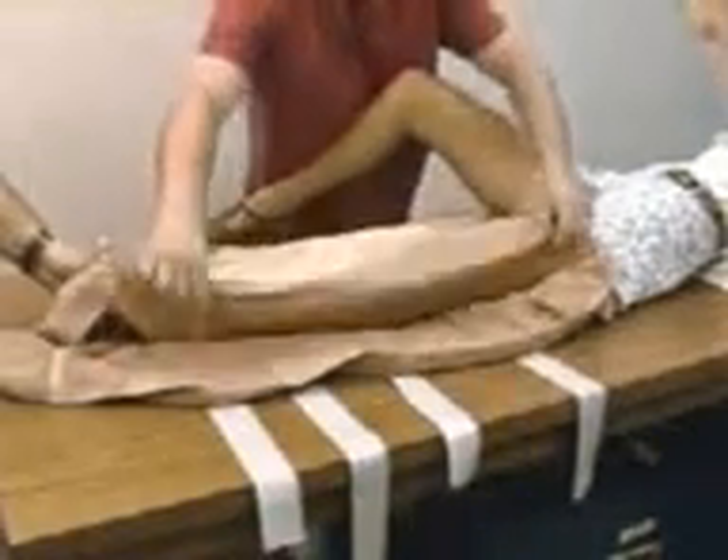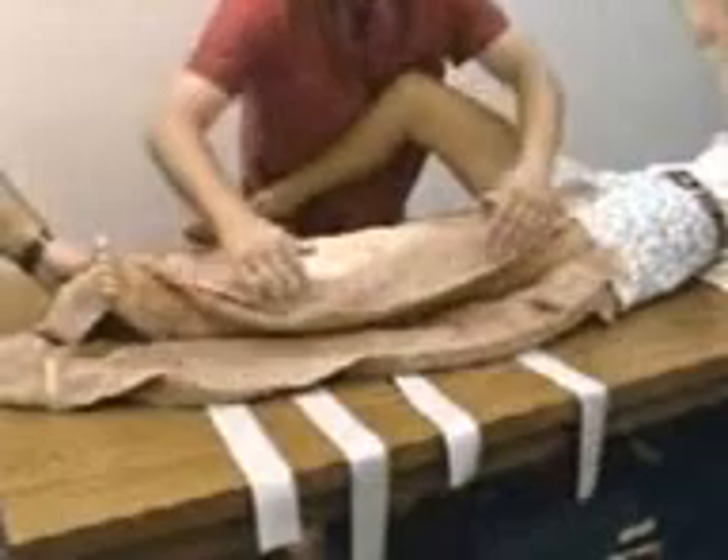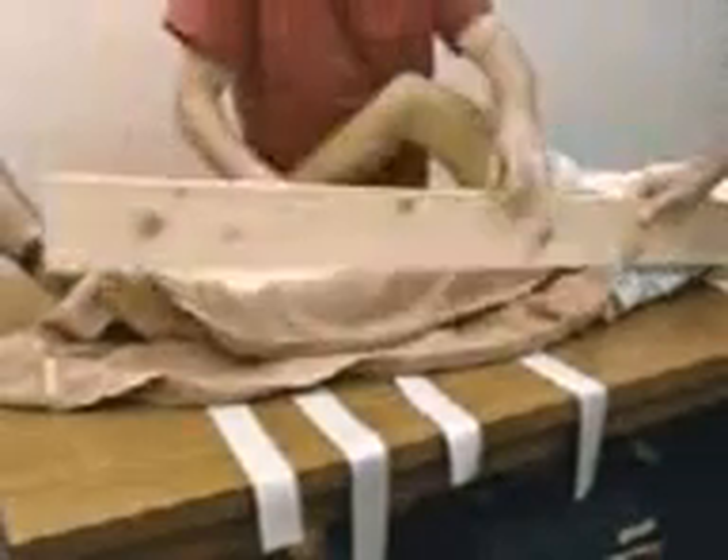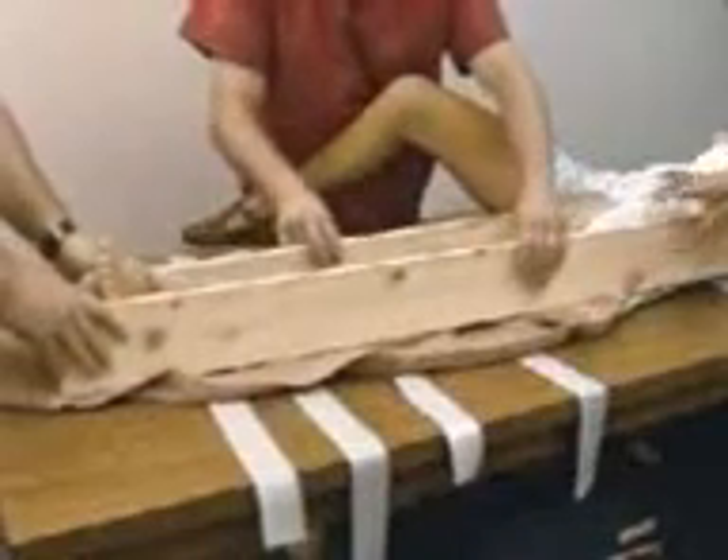Emergency splinting of the femur fracture begins with gentle traction to straighten the knee joint. With adequate padding, place parallel splints along the sides of the injured limb.